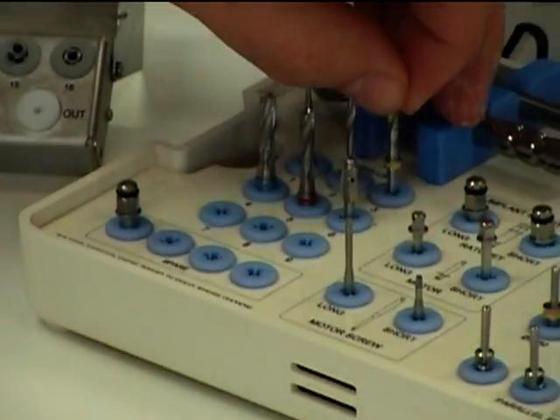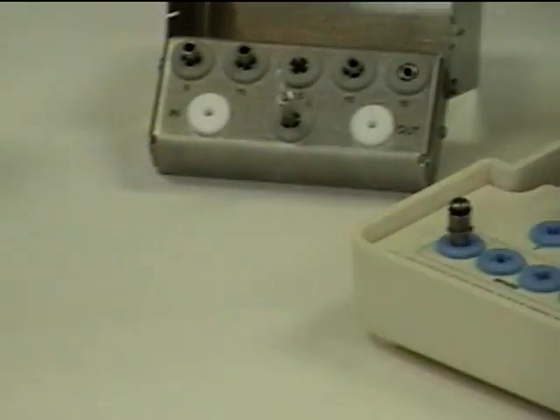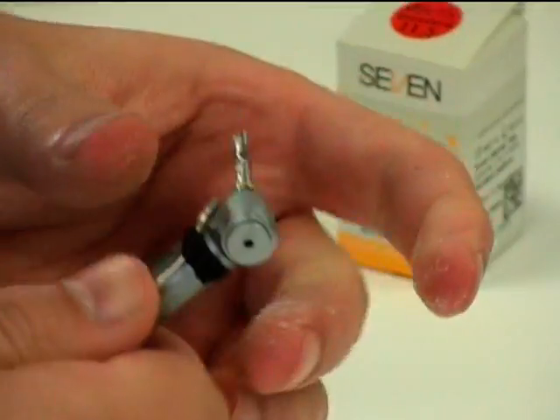Next up, the 2.8 millimeter twist. This time I'll go without the drill stopper, meaning I have to pay attention to the depth markings on the sides of the drill.